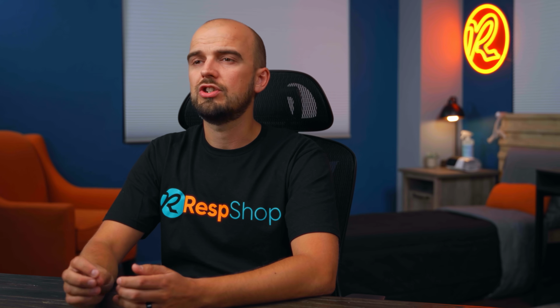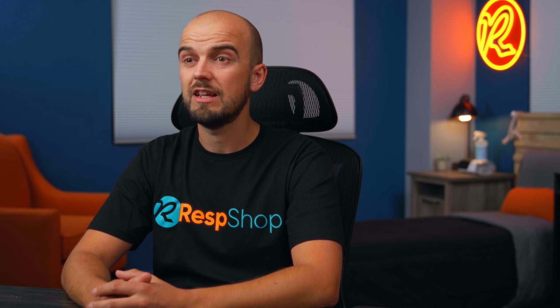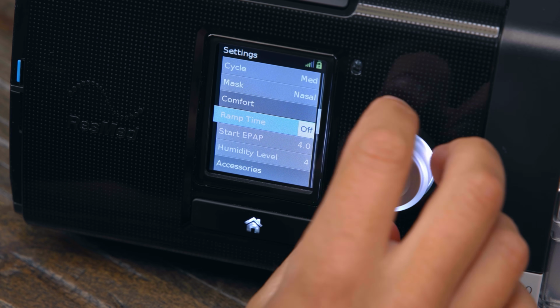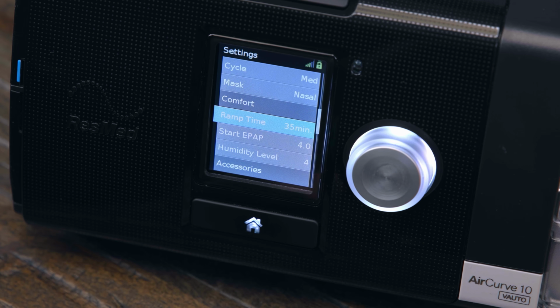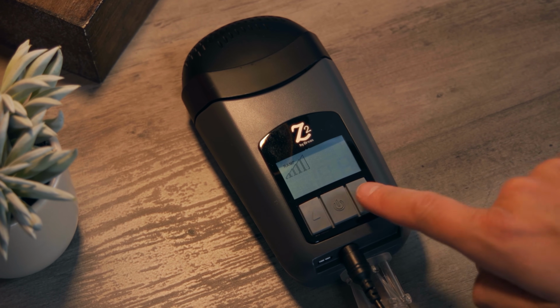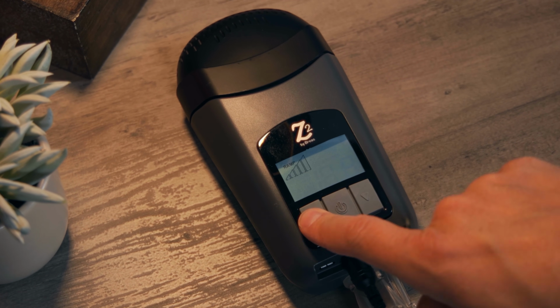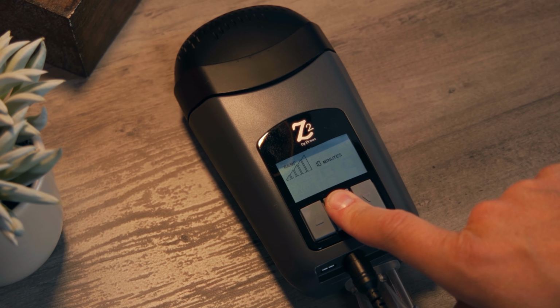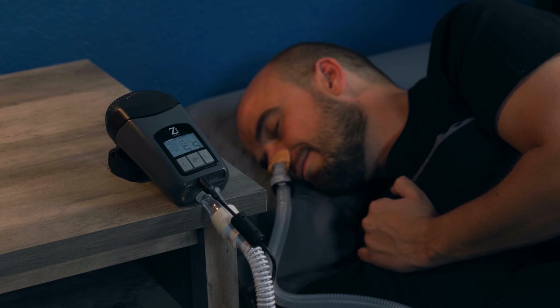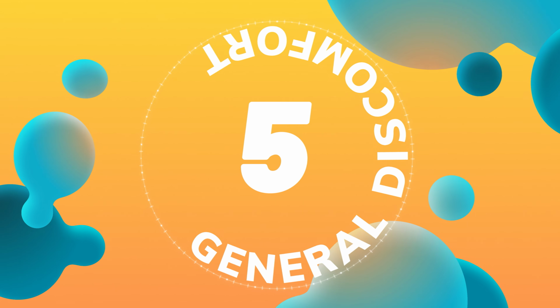If too much pressure is a problem when you're trying to sleep, then there's a feature on almost all CPAP machines that's called ramp. The idea here is that the pressure begins at a lower level while you drift off and then ramps up to therapy pressure either over a set period of time or automatically when the algorithm detects that you have nodded off. And reducing your pressure settings while you fall asleep by turning on ramp will typically lower the noise while you drift off as well. So look for the ramp feature in your settings menu and check that it's on if this is a problem for you.